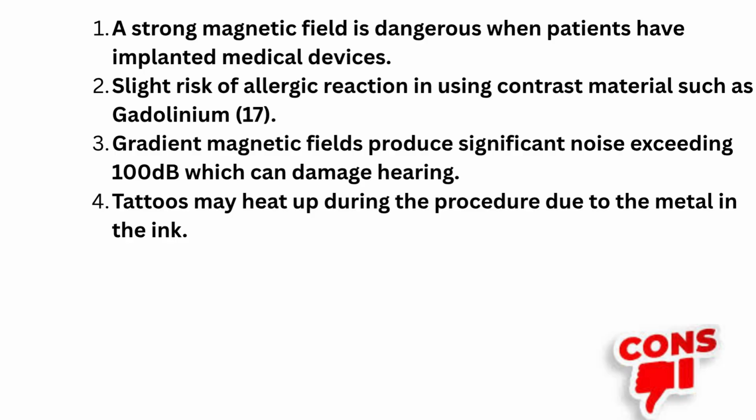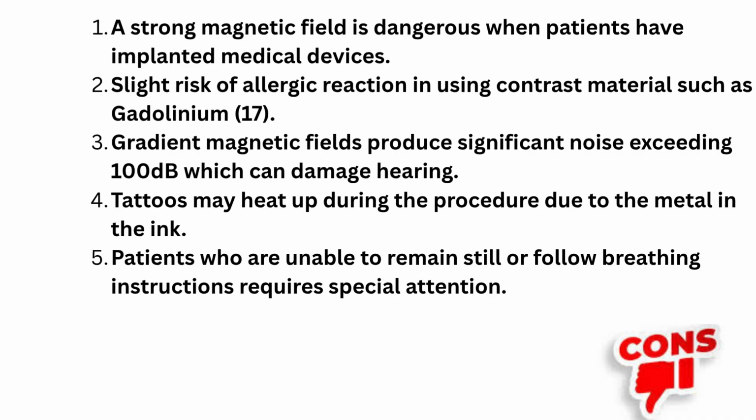To avoid this, tattoos under 6 months require a rescheduled MRI. For older tattoos, ice pads or padding are placed over them to avoid overheating. Patients who are unable to remain still or follow breathing instructions require special attention. Sedation or immobilization aids can be used to help with this. Individuals with high body mass index may not fit into standard MRI scanners. To accommodate these people, wide-bore or open MRI scanners can be used.